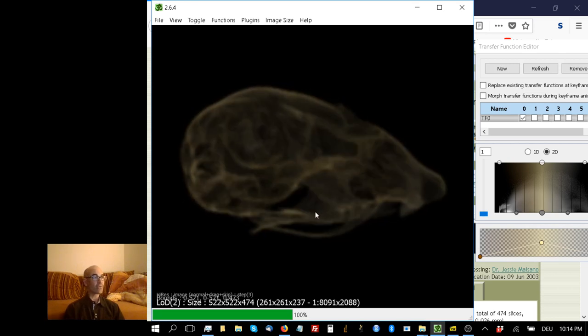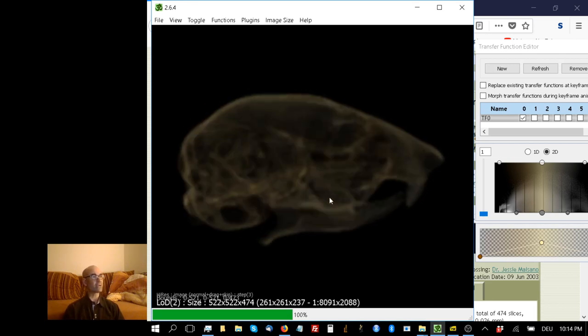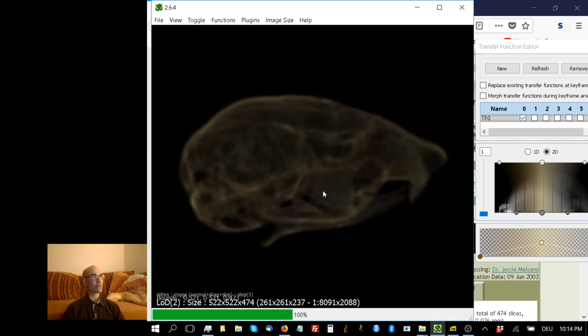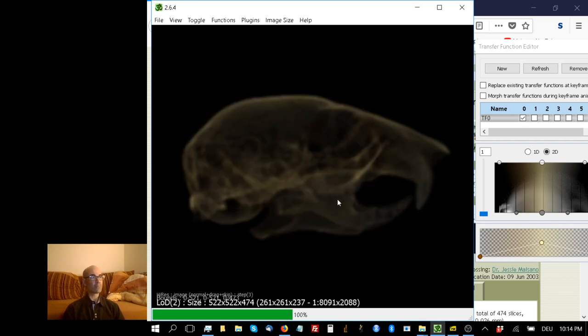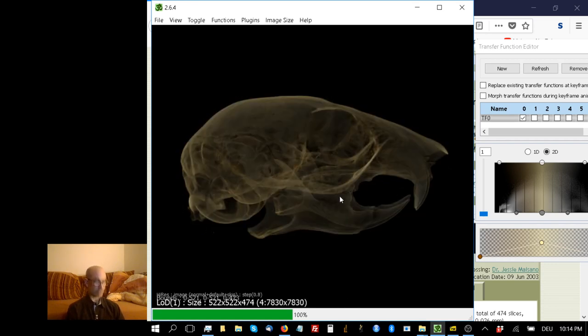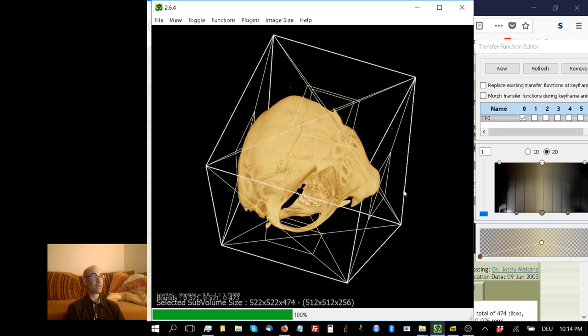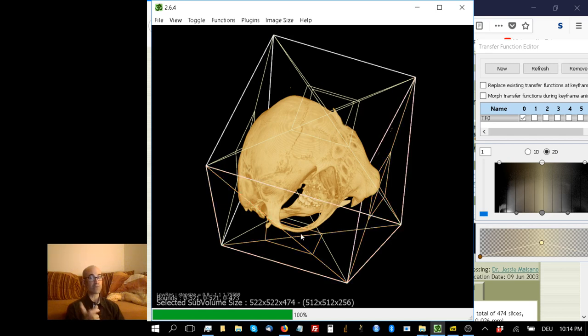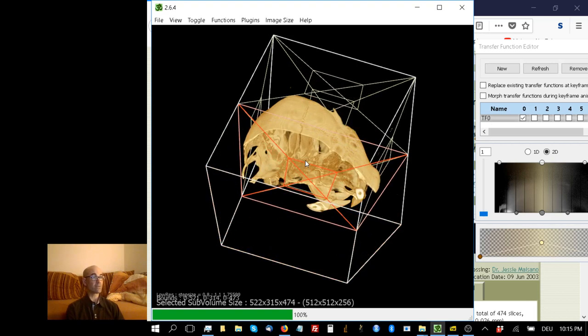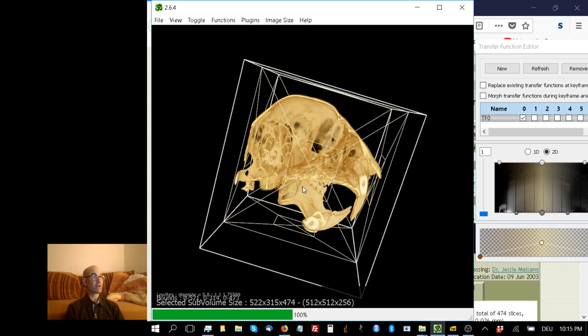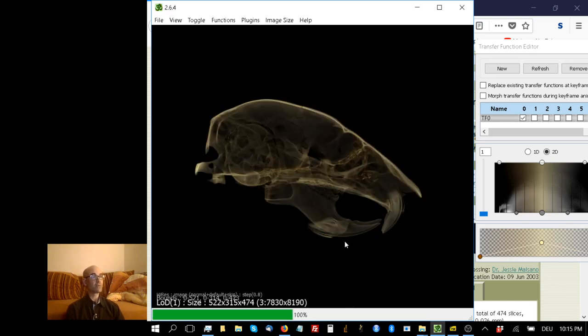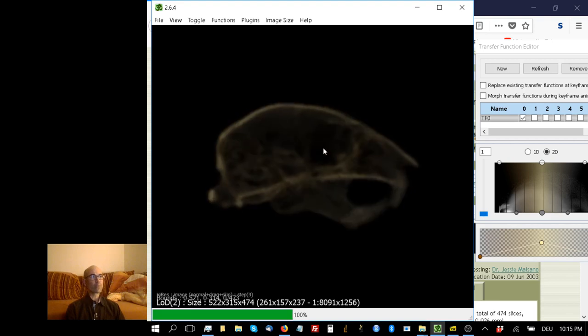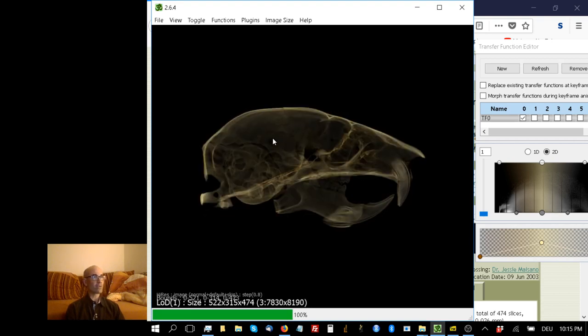There are a couple other things here. It's a little translucent, so that's not really going to make for a terribly nice publication quality figure. If we go back to low-res mode, I'll hit F2 again. I can right-click on any of these anchor points to change the view. If I want to see inside the brain case, I can do that. Then I hit F2 again to move into high-res mode.